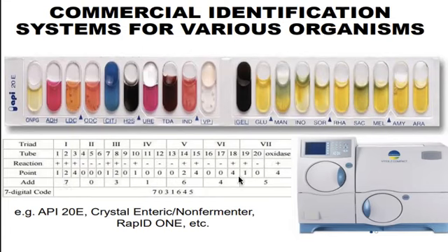Ganyan. Isusulat mo. Okay. Tapos i-add mo ngayon yung reaction lang. Di ba sabi ko nga kanina, tig tatlo-tatlo. Okay? So titignan mo ngayon yung reaction. Okay? Per 3 tests. Tapos i-add mo. So 1 plus 2 plus 4. So itong 1 and 2 is based on, meron naman tayong ginagamit na color chart, no, to determine kung anong number yung reaction na nakikita natin dito. So tube number 1, 1 lang yung kanyang reaction. Si number 2, 2. Si number 3, 4 ang kanyang reaction. Ganon. And then i-add mo yun silang tatlo. So 1 plus 2 plus 4, 7.